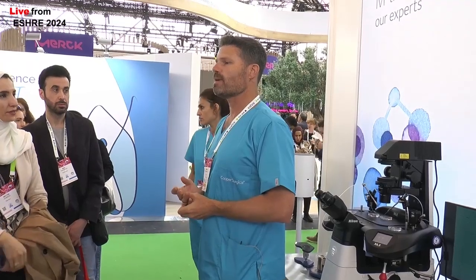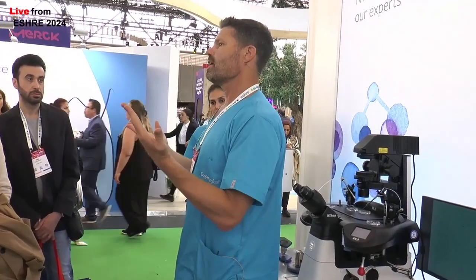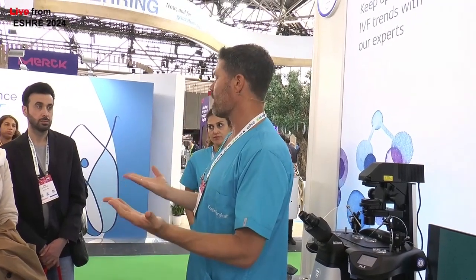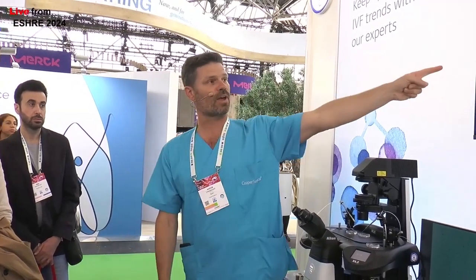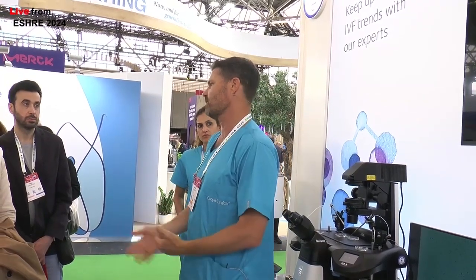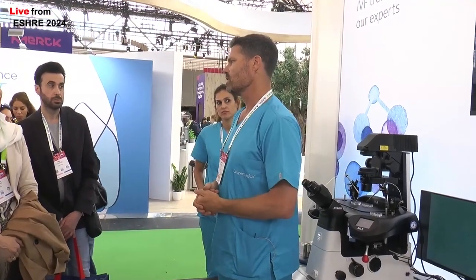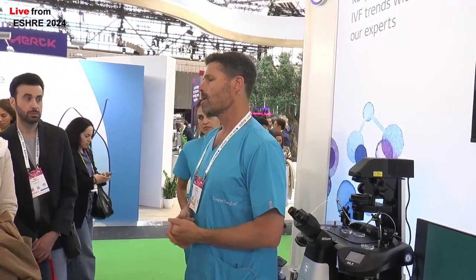Three of them. So does it make a difference if we load a different concentration in each drop? As far as binding, no. But practically, as far as trying to catch the sperm, it's going to make it easier or more difficult. So these are the small little tricks that we try to show when we do demonstrations to help people in doing it.